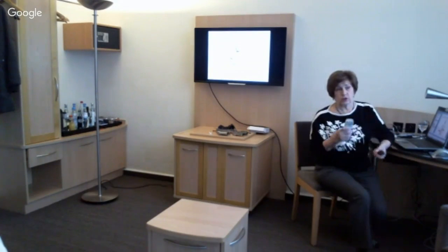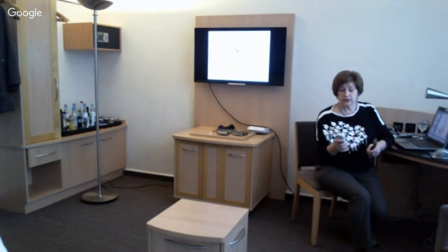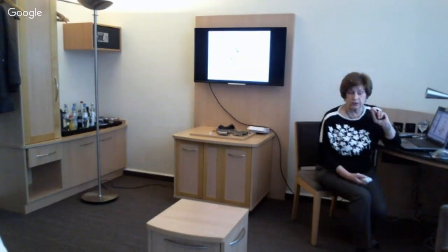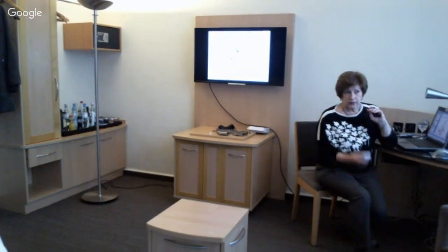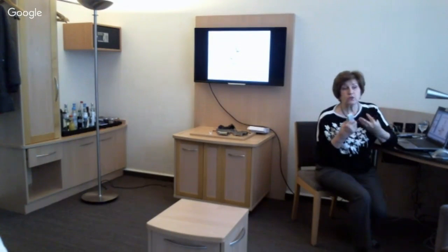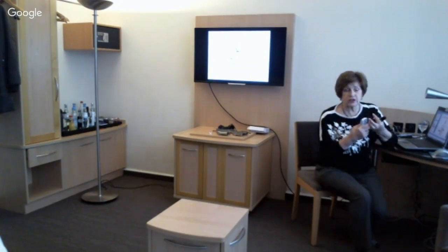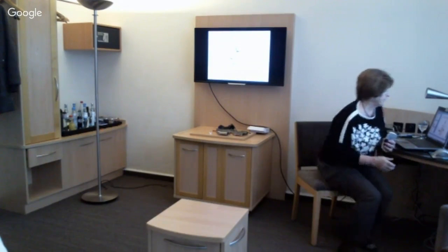In this situation, we set the frequency of 340 Hz, but we can set FM in this device. Best of all is to change some parameters, the frequency and the speed of stimulation.